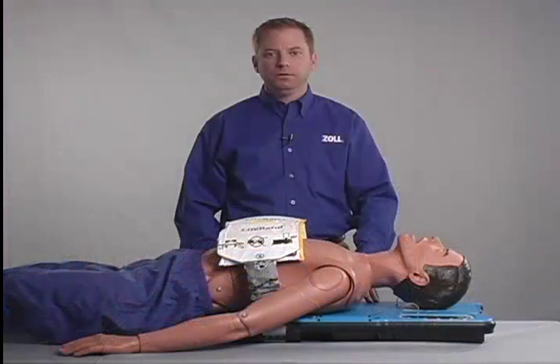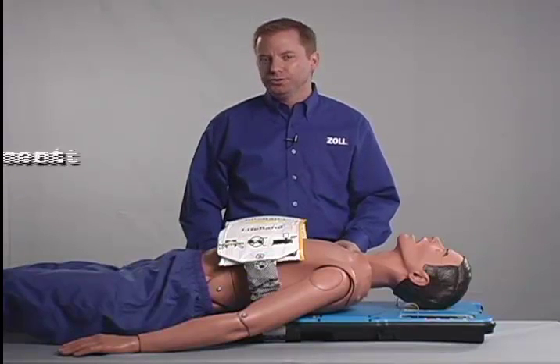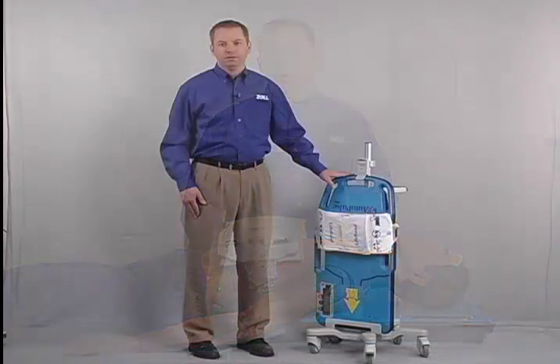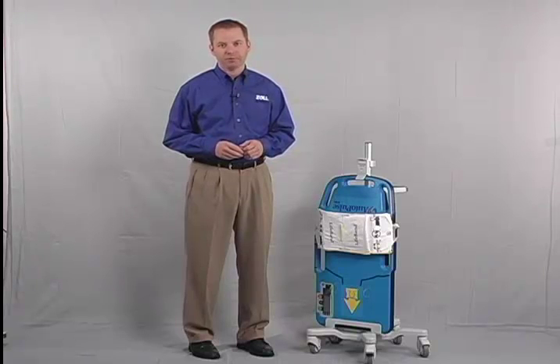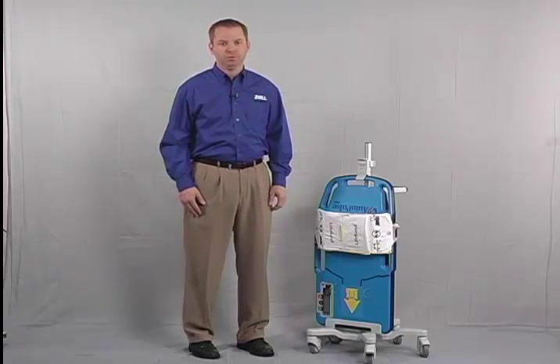Once again, please remember that the keys to successful autopulse use are early rapid deployment and minimal pausing or no-flow time. The autopulse can't work miracles. However, when used as instructed in this video, it will help you to improve blood flow in your cardiac arrest patients, thus giving them a better chance of returning to normal, productive lives.